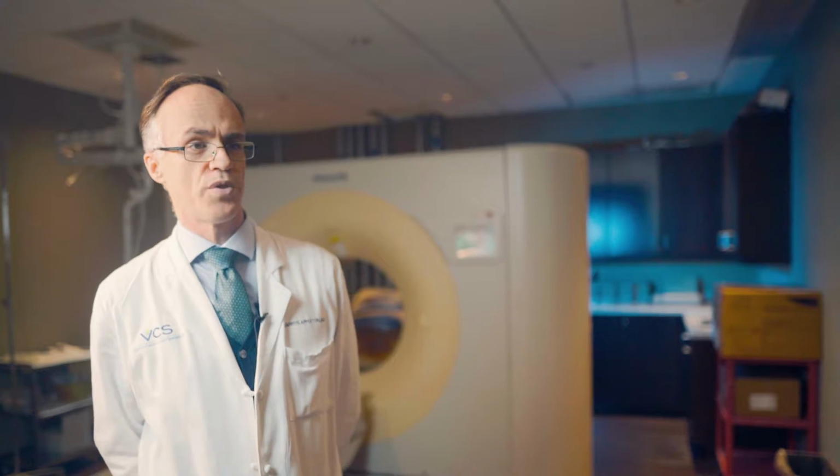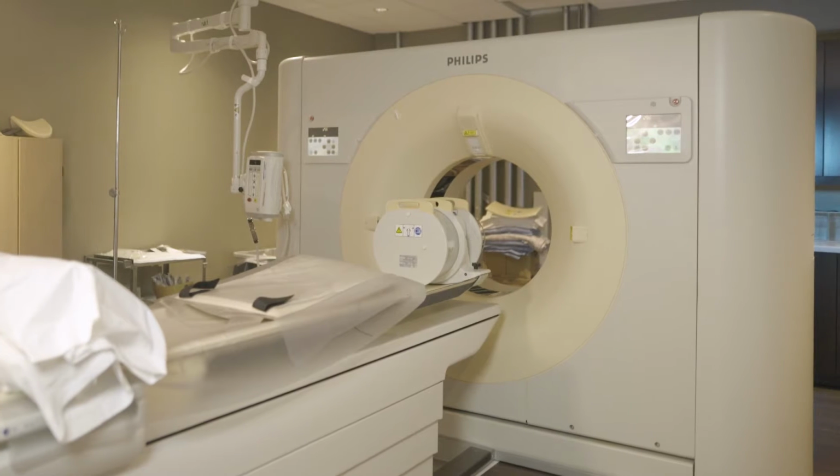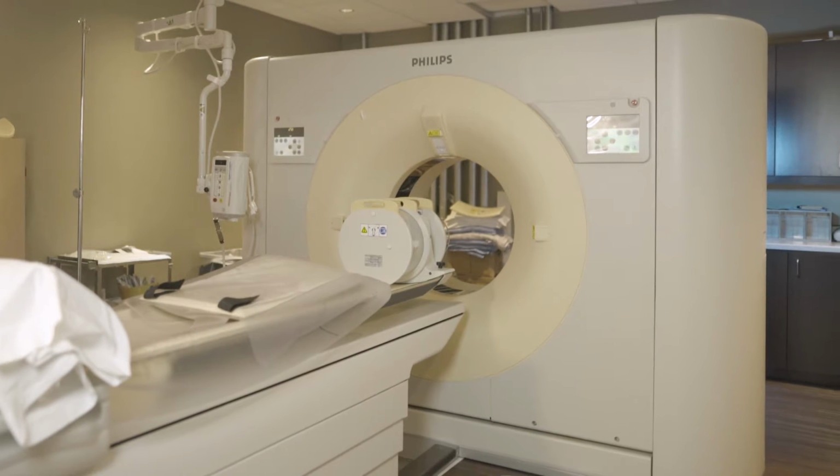FFR is an abbreviation for something called fractional flow reserve. That's a technology that comes out of the cardiac cath lab. Oftentimes we're faced with patients who have intermediate risk of having a particular diagnosis, and this helps them to get a good diagnostic test that helps determine whether there's really a problem to be further evaluated without the risk of an invasive study. Typically the scans are very quick, and usually we get the results back to them pretty quickly.